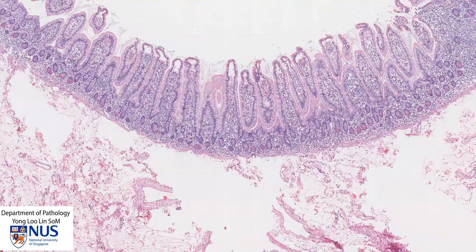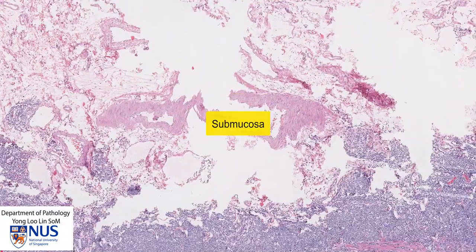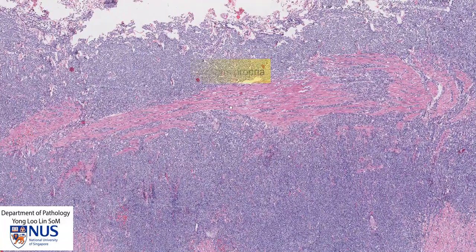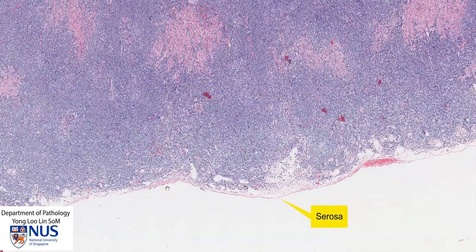Just deep to the mucosa, we have the thin muscularis mucosae layer, which is the smooth muscle layer, and then we have the submucosa and the muscularis propria. We can still see some smooth muscle bundles here, but this is very much infiltrated by lymphomatous cells. And then, of course, we have the serosa.